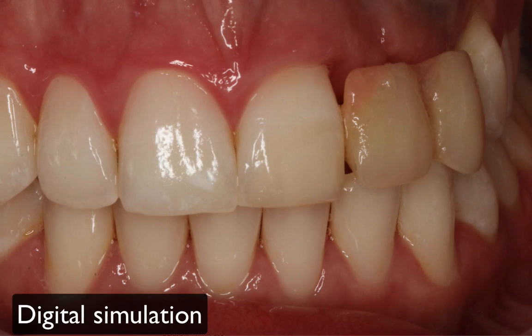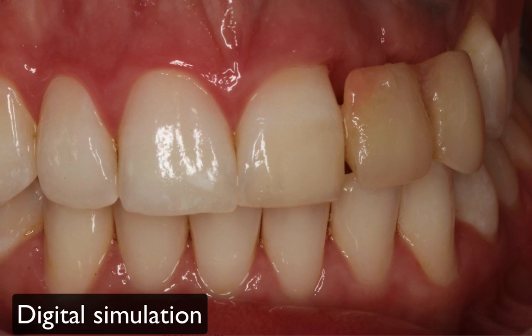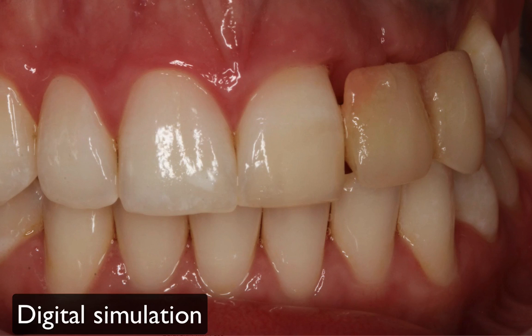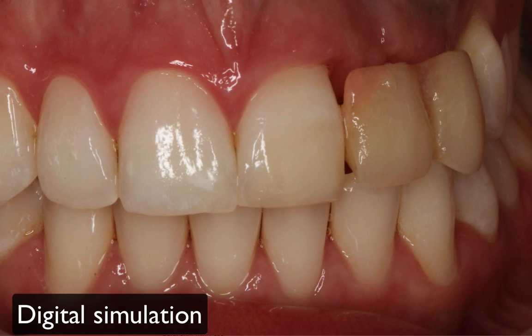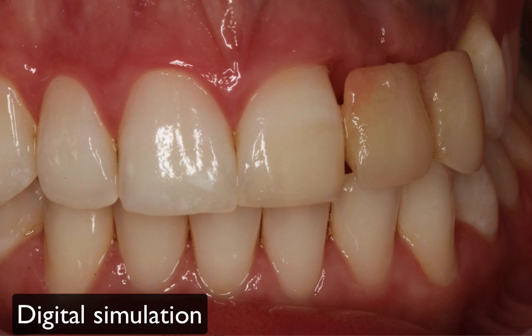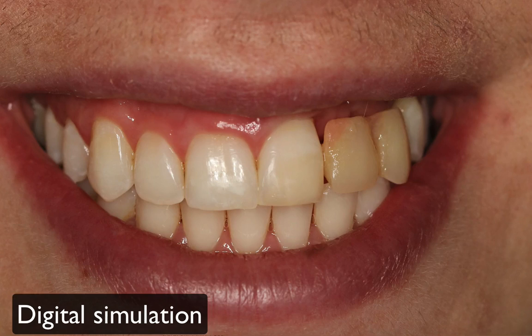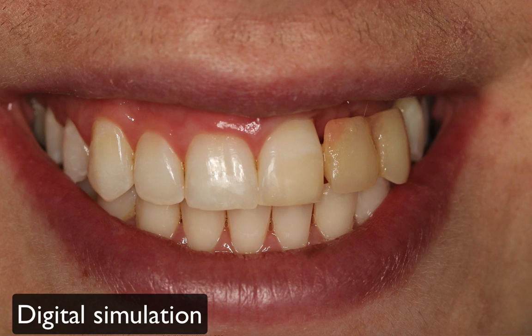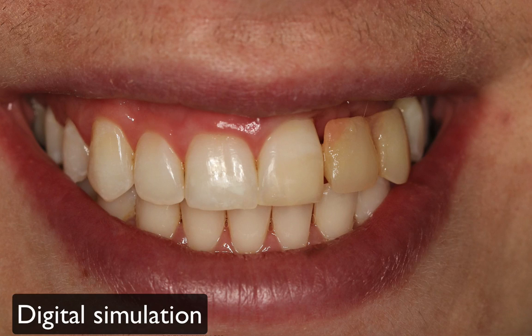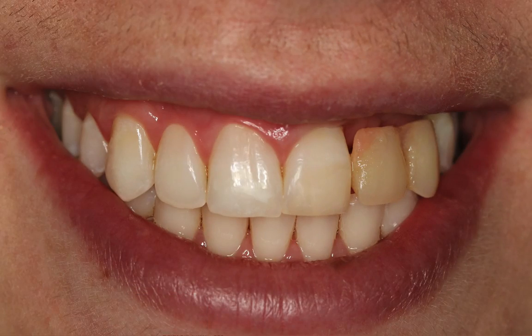So the first thing that I did, I did a digital simulation and I lengthened the lateral and central incisor on the right to try and match. And I think it gives us a little bit of a better flow in terms of the gingival margin. Here we see the smile.